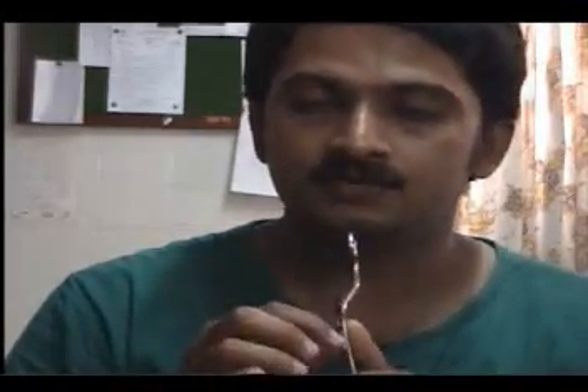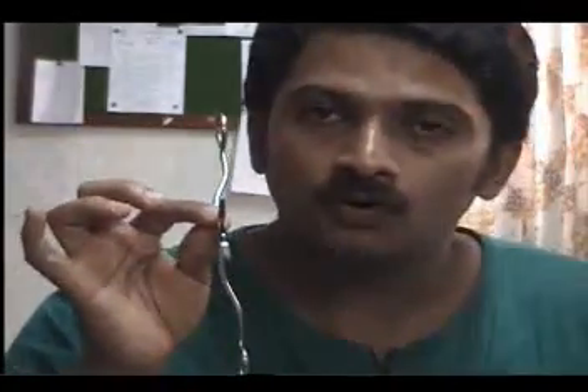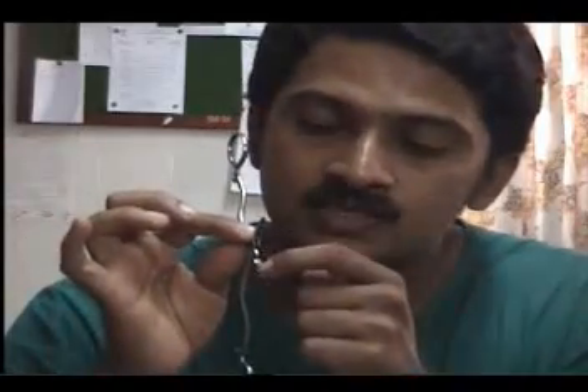In addition to that, it has a slot inside which is not seen in this particular model. This slot allows you to hold the needle tightly without making the needle straight. If this slot is there inside, the instrument is definitely a needle holder.